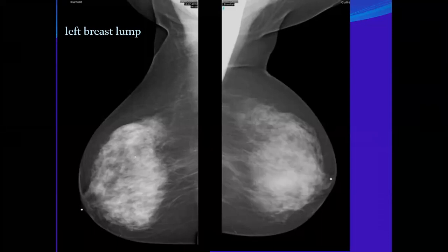Asymmetry because it is one view. Excellent, well done, Magdalene. Because this is not an optimum mammography. Even this asymmetry can be related to malposition. This is not a good mammography to comment on.